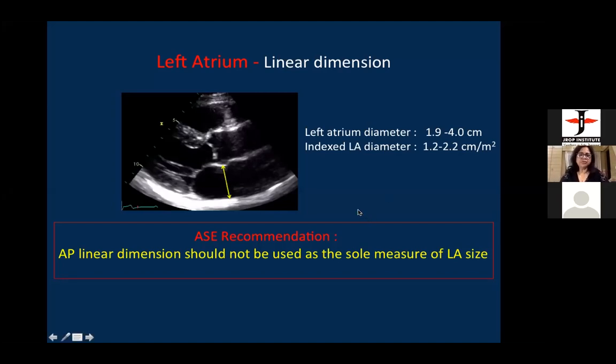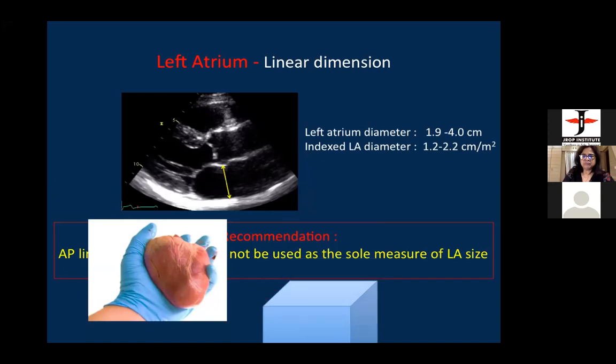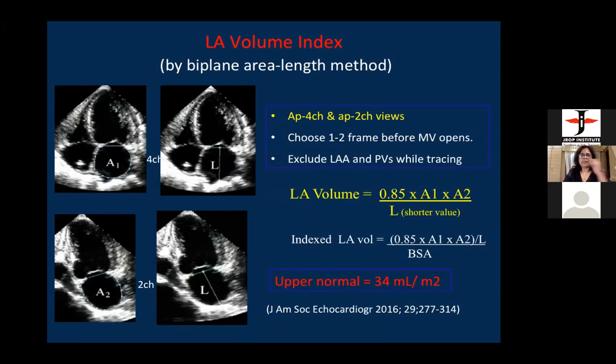Sir, you want to say, sir? How to measure LA volumes? Just show you how to measure the LA volume. Go to 4-chamber. Yeah, perfect. That is what she's looking for.